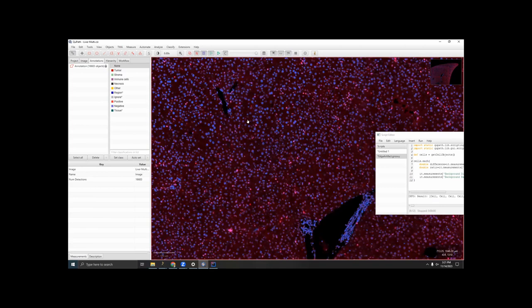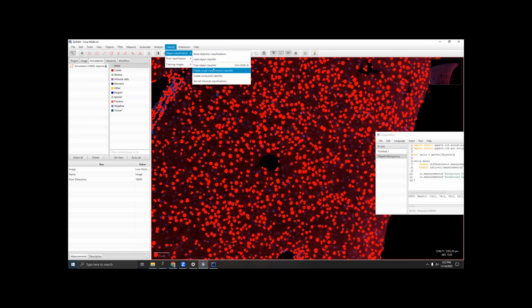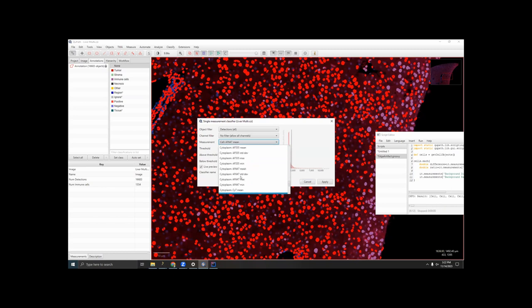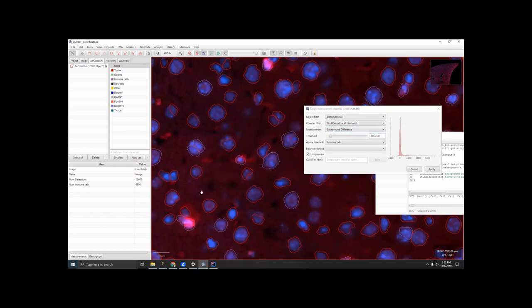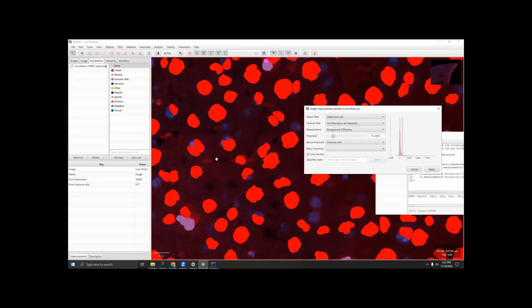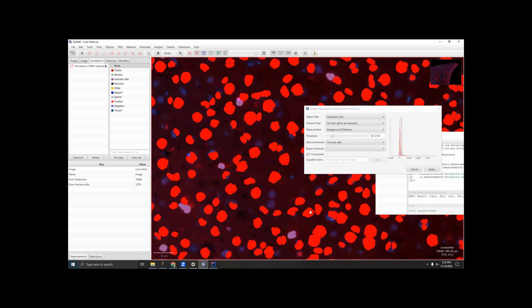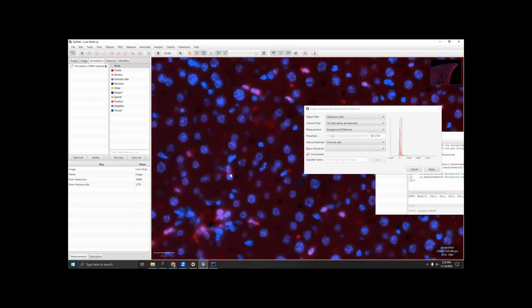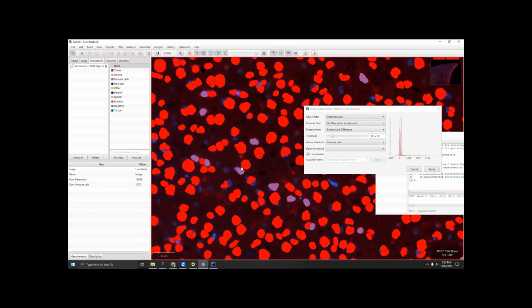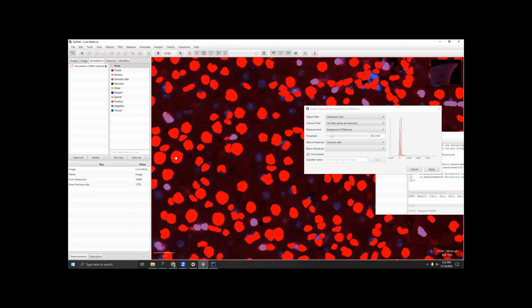Okay, let's see if this actually helps. Let's try to create a thresholder and see if it helps. Background. Let's start over here and find a setting that gets all or most of the positive cells. That looks good. What it's showing up as purple overall looks pretty reasonably positive. It's not perfect. My segmentation isn't perfect. Be a little bit lower. Yeah, something like that. Okay.